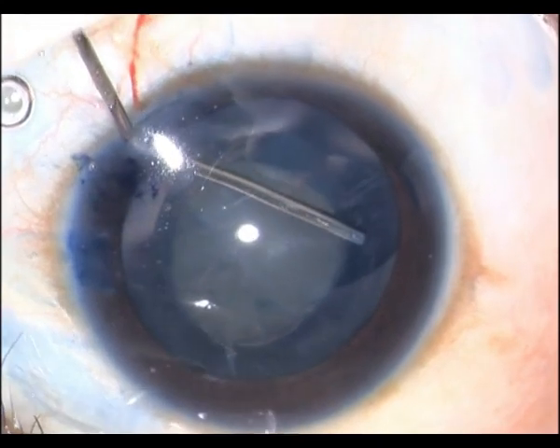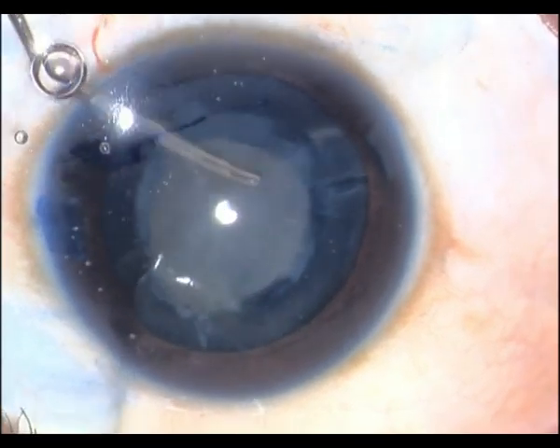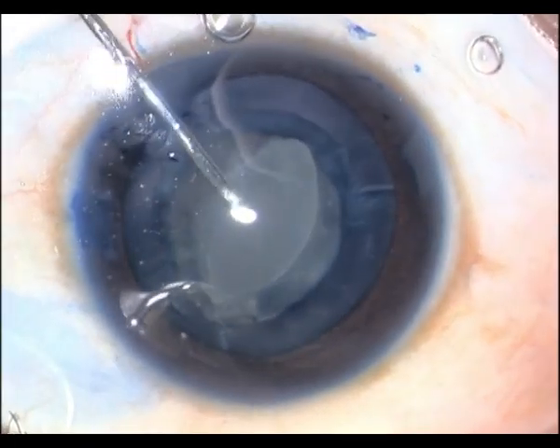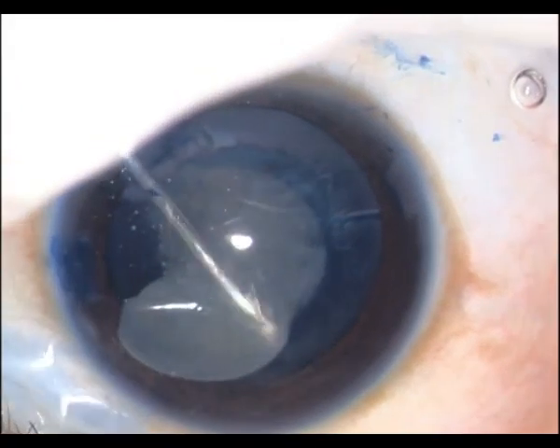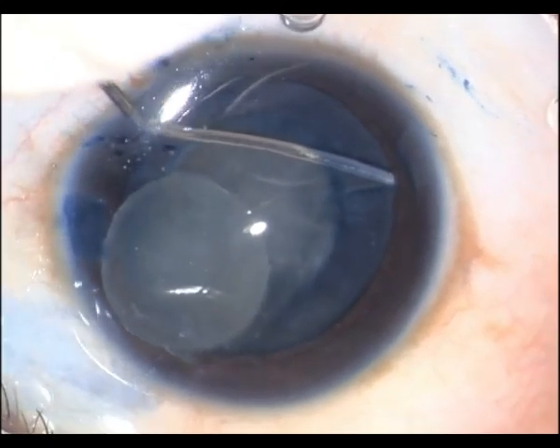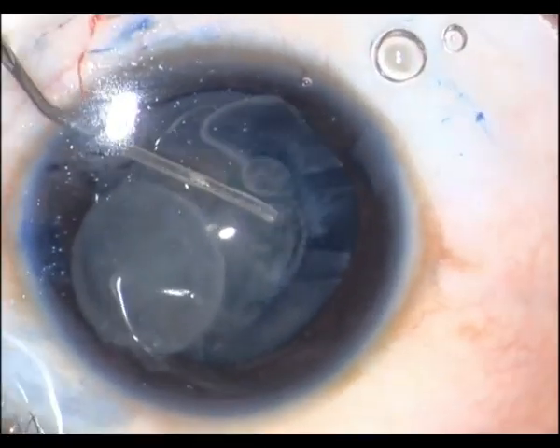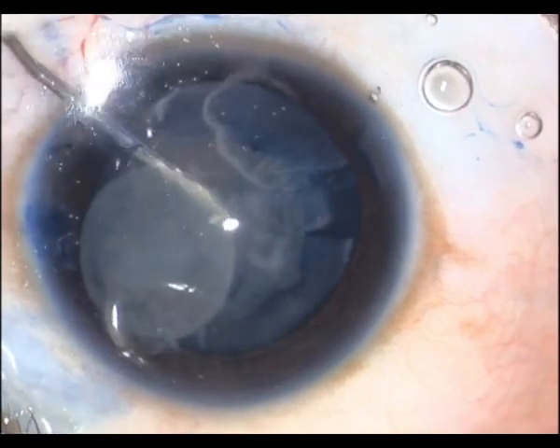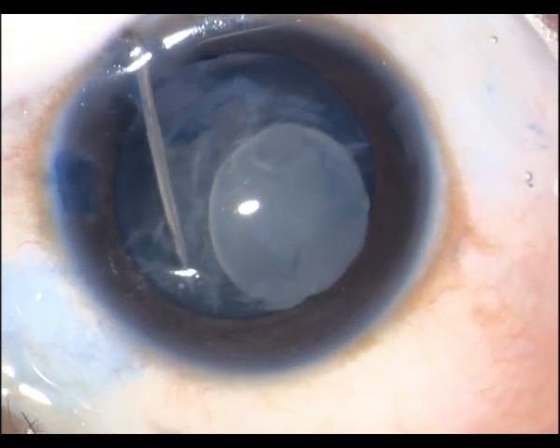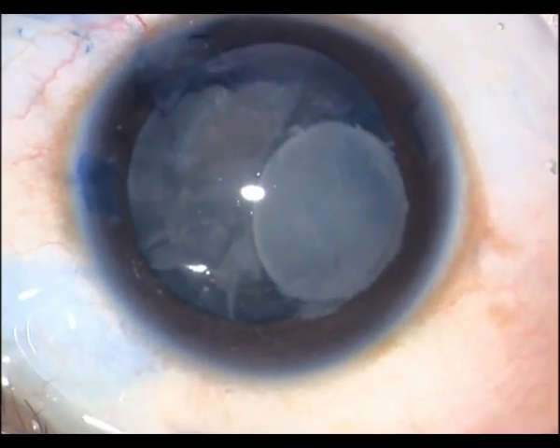Hydrodissection is pretty simple. It has delineated as well, and the nucleus has in fact prolapsed out. I am just making sure that I have adequate hydrodissection so that it is easier for me to take out all the cortical material.